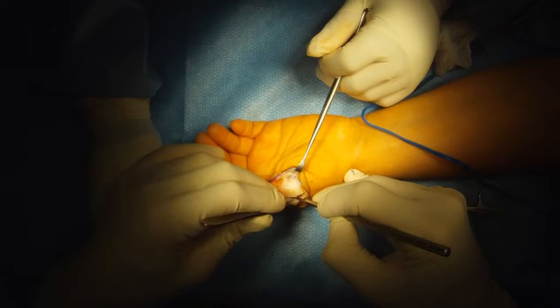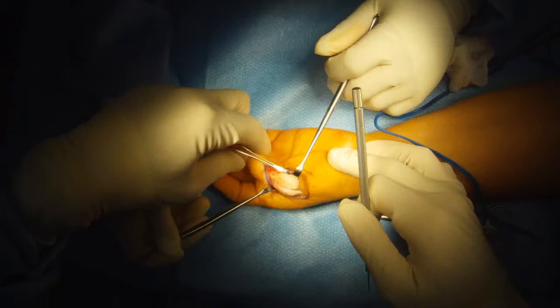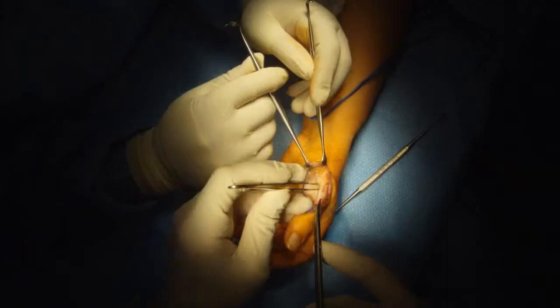I release one of the collateral ligaments, which is scarred in, then release the other collateral ligament that is also scarred in. This should allow us to have full joint motion, which we do. There's full motion of the joint.